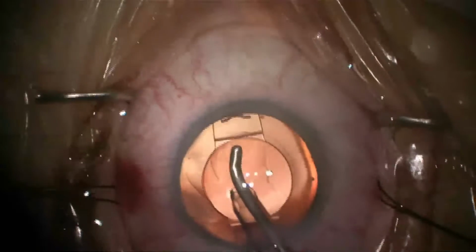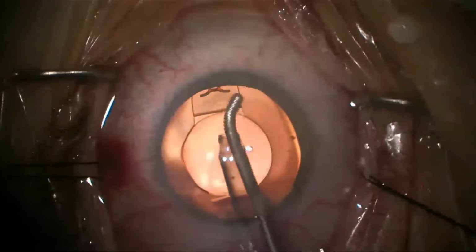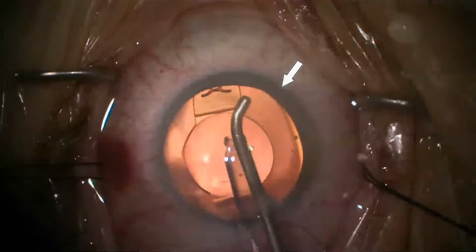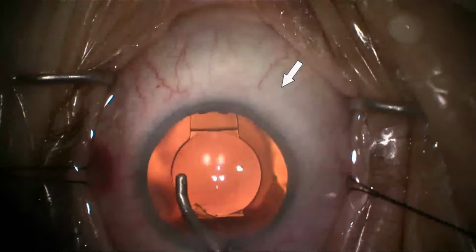Now a nice view, a good deep chamber. Dimple, press the button, release, and see the iStent inject in beautiful position, 2 clock hours away, with a nice reflux of blood, indicating good placement and good connection into the venous system. Now I'm going to remove viscoelastic like any other cataract surgery, and what's kind of cool, and I love seeing, is the blanching you see while removing viscoelastic.